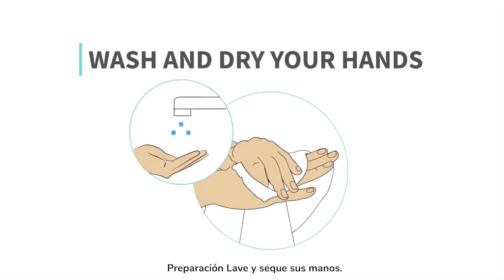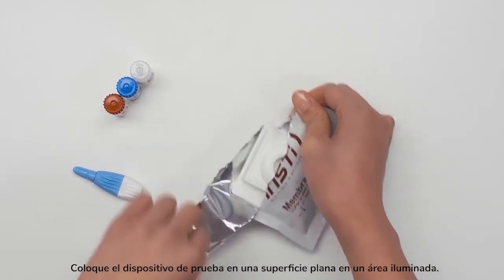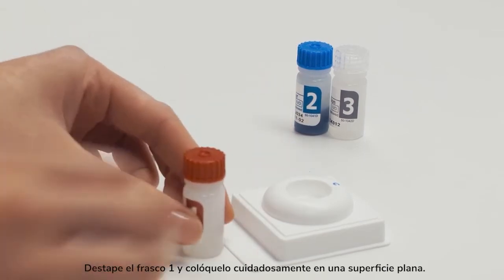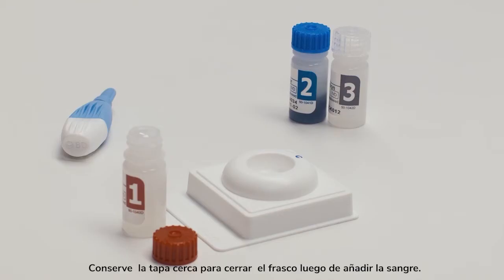Wash and dry your hands. When you are ready to start, open the test device pouch and place the test device on a flat surface in a well-lit area. For Bottle 1: remove the cap and place the bottle on a flat surface with care. Place the cap nearby to recap the bottle after you add the blood.